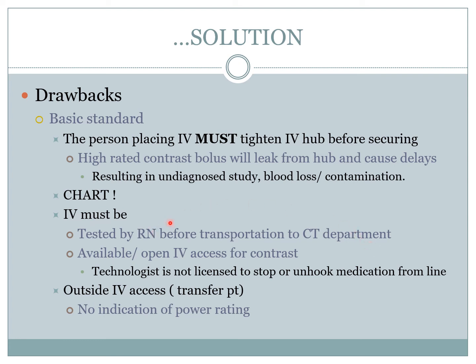So there's no delay, no taking the patient back and forth, because at our hospital, if they're inpatients, normally the nurses have to put it in. And like I said, we have hundreds of scans a day, so there's no time for us to do that. So they actually have to go back.